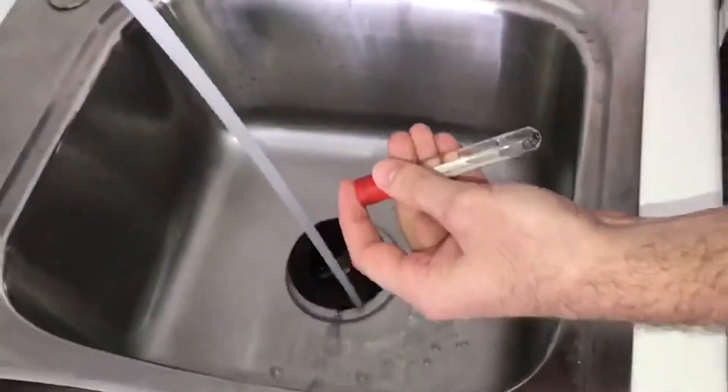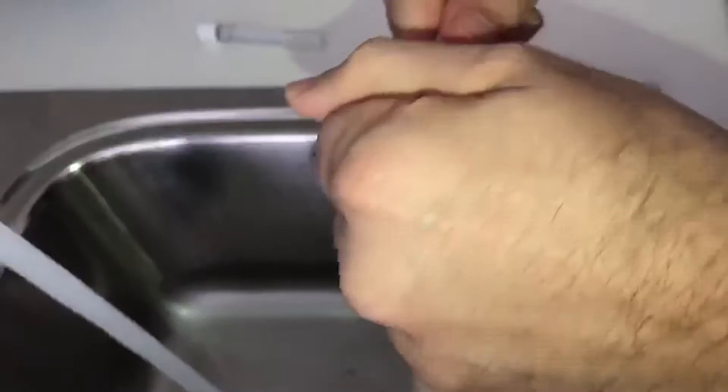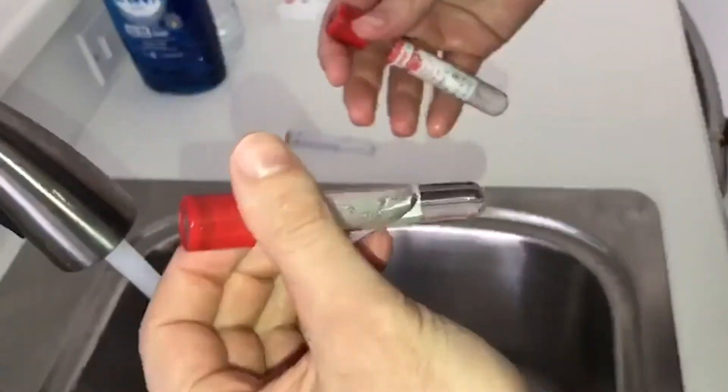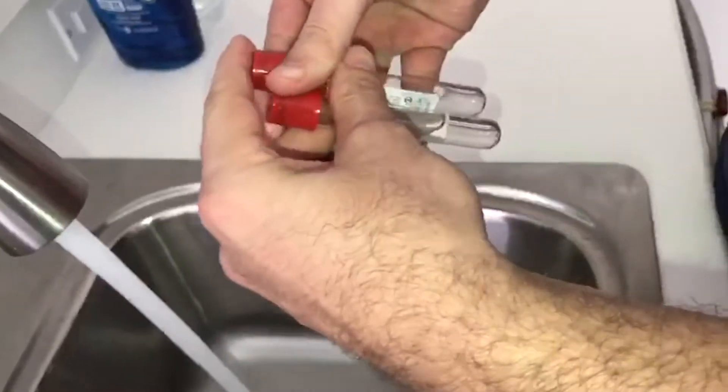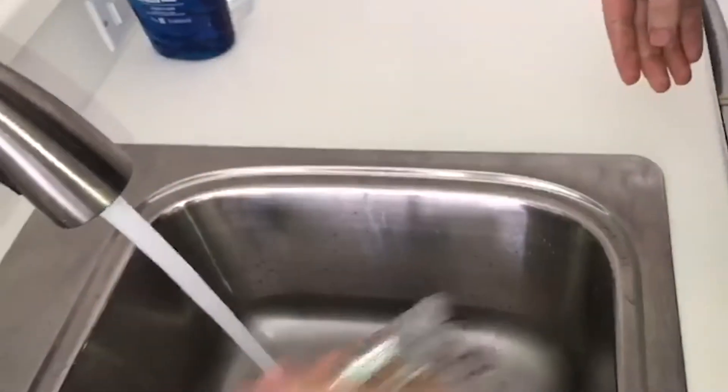Now look — because everything's gone, you don't see anything. If you let these sit for a little while, the bubbles will be removed. So here are the three tubes: the first one I've rinsed, the second one, and here's the white tube.